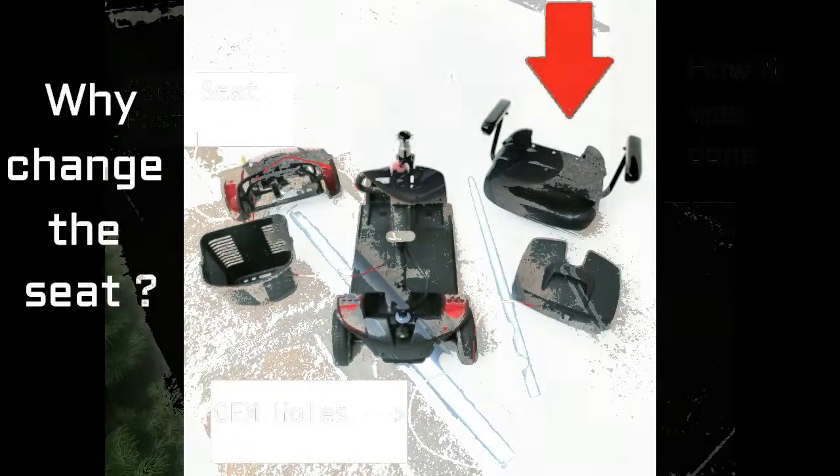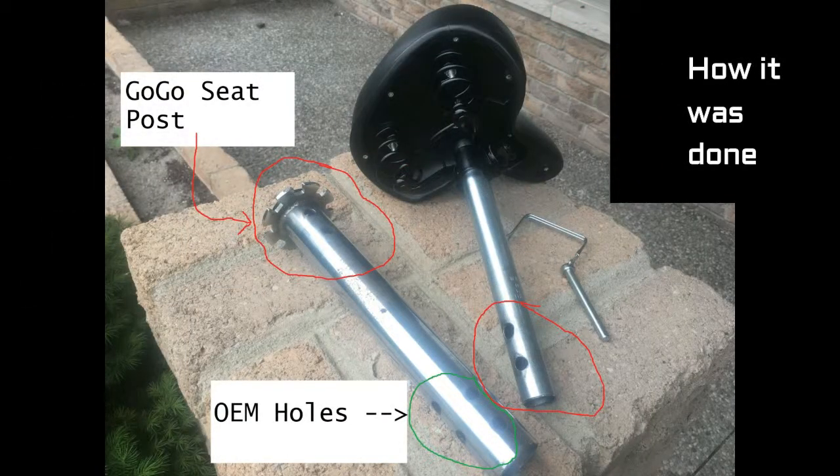Here is how the seat conversion was completed. On the right-hand side you have the bicycle seat shown in black at the top. Attached to it is a replacement seat post, and to the right is a trailer hitch quick-release pin. I bought all those items on Amazon — the seat was $40, the post was $10, and the pin was $9. Those are the new components.